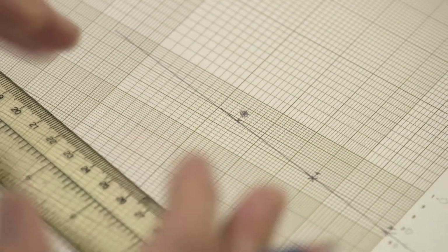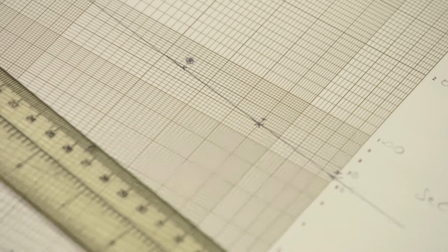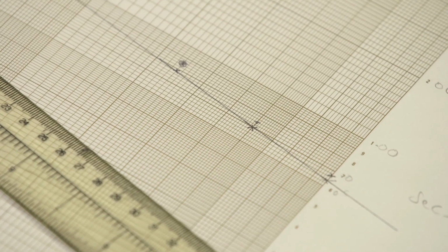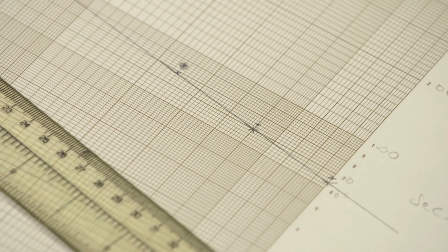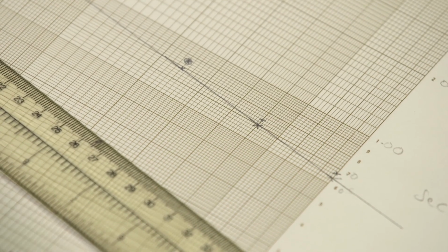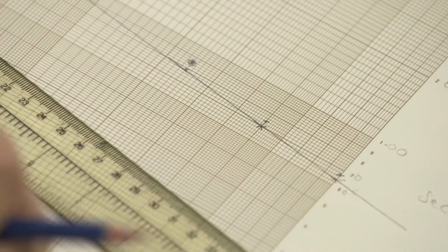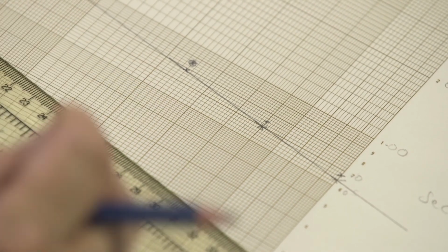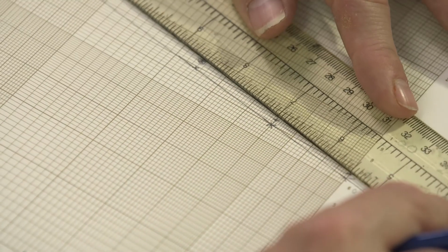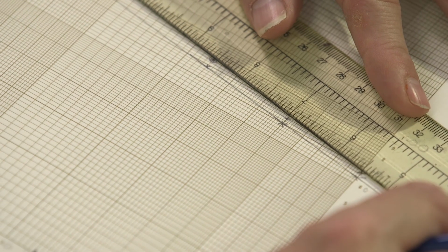So now we have to ask a question for the IQC sample. Do the 3 points form a straight line relationship? And is that straight line parallel to the standard? These are the 2 important criteria for a valid assay, that means it's safe to compare, in this case the IQC, with the reference material. Is it a straight line? Is it parallel to the standard? So we now need the best straight line, and the question, is that parallel to the standard?